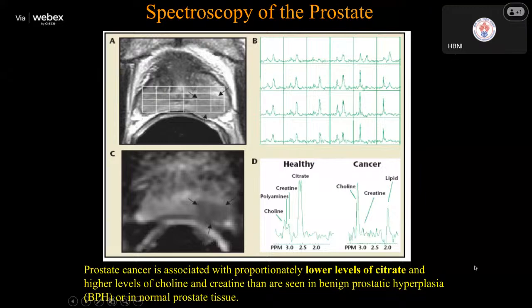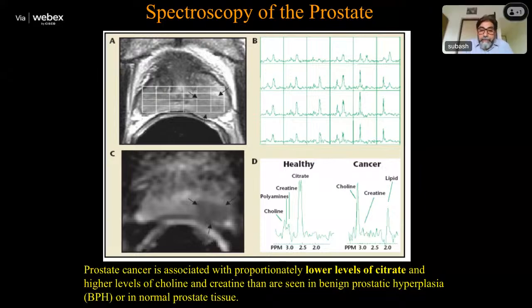Okay, so good afternoon. In the last lecture, we studied in vivo spectroscopy, and we essentially covered hydrogen spectroscopy. We looked at the spectral parameters, and then saw the application of hydrogen spectroscopy in characterization of lesions, the brain lesions or lesions elsewhere in the body, and also how we can characterize the tumors, whether the tumor is grade 1, grade 2, or grade 3.